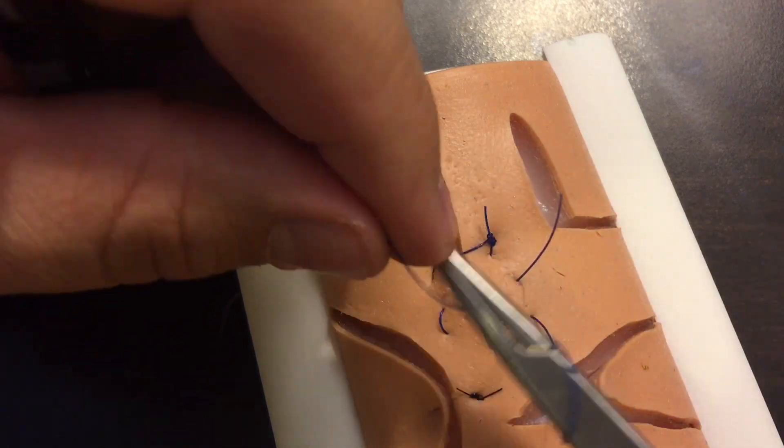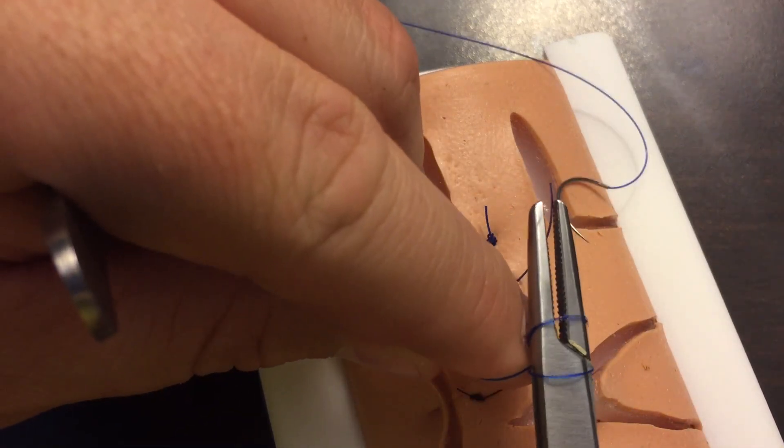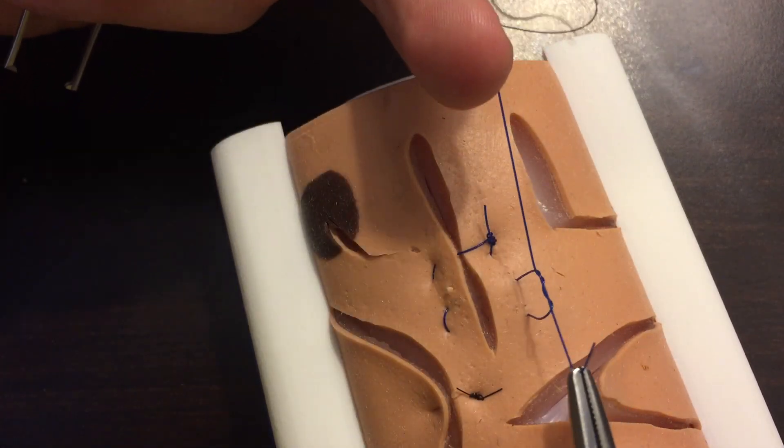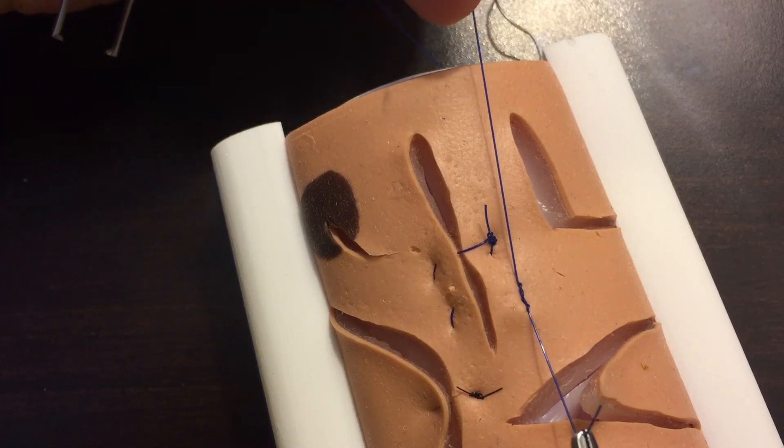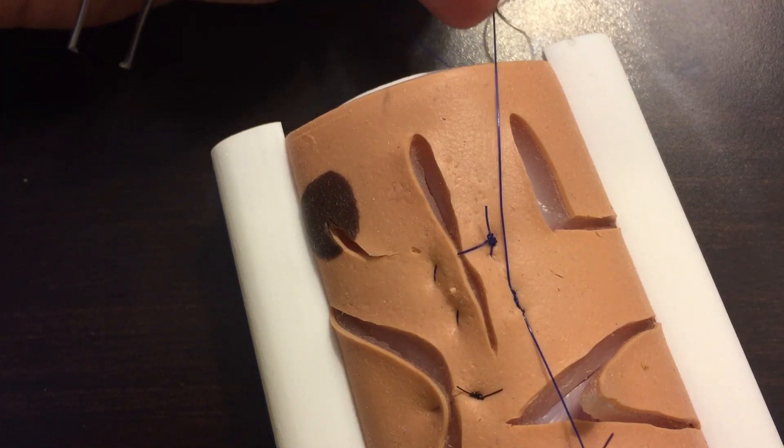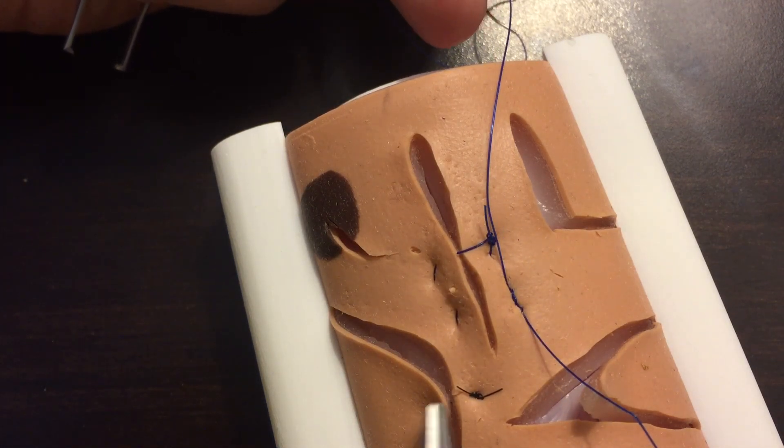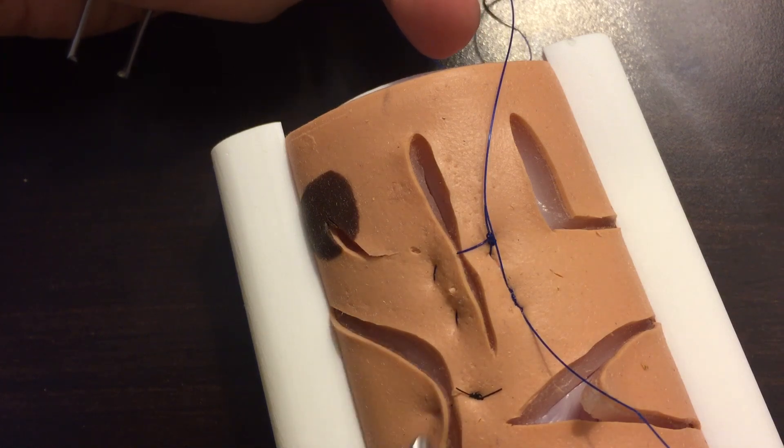If I use a horizontal mattress, most of the time I'm going to be using it as my point suture to pull together a gaping incision or gaping laceration like this.